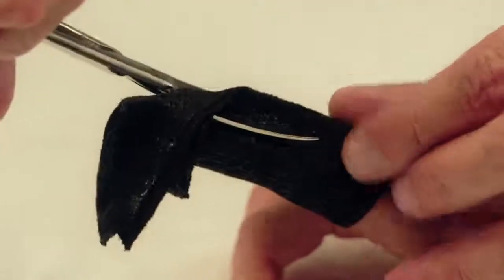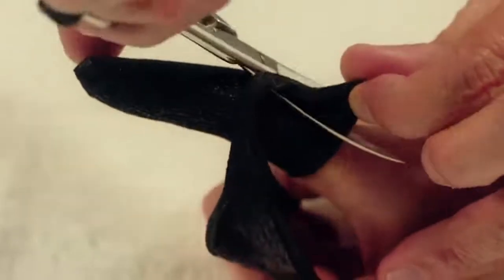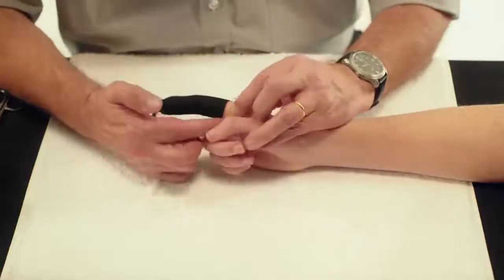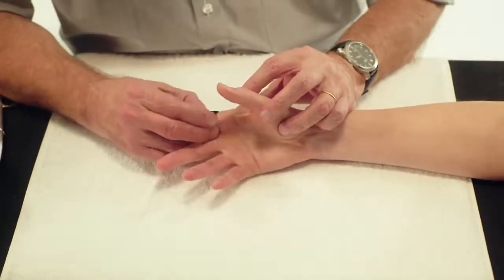As close to the skin as possible, roll the edge of the orthosis on the palmer side upwards to smoothen the edge.